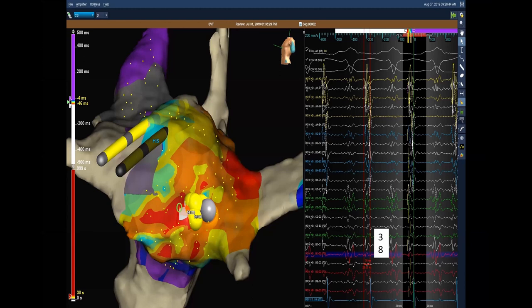This is a patient where I mapped the exit during AVNRT and put a multipolar catheter on the septum. It's really just showing that this is where the slow pathway exits with conduction down the fast pathway. This is where it comes back out through the slow pathway, and it can be a guide as to where to ablate atypical AVNRT.